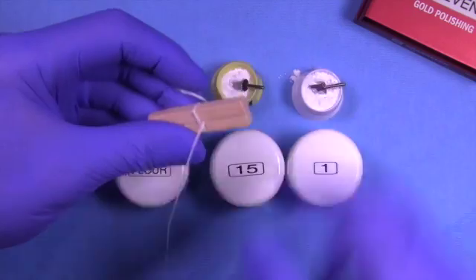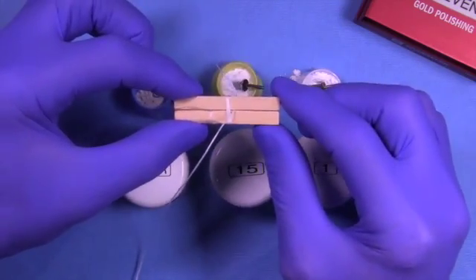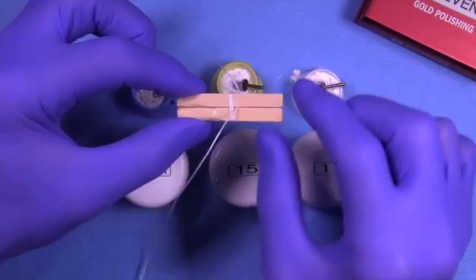When the rubber dam is in place, the bow of the clamp is going to impede the patient's ability to close down. So we can utilize this double bite stick over the casting and have the patient bite down forcefully.